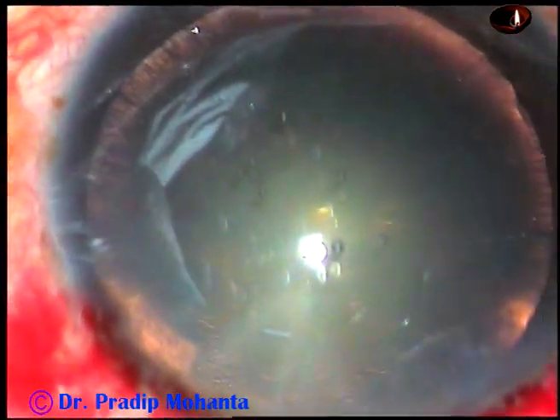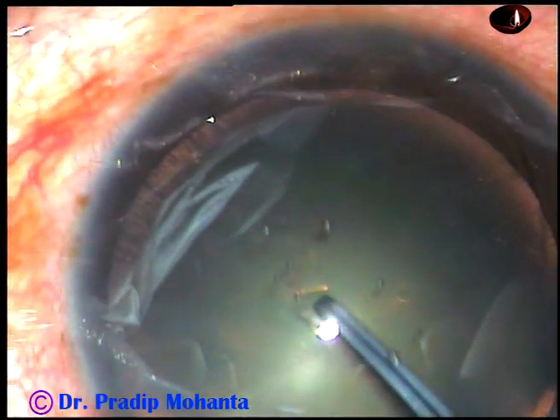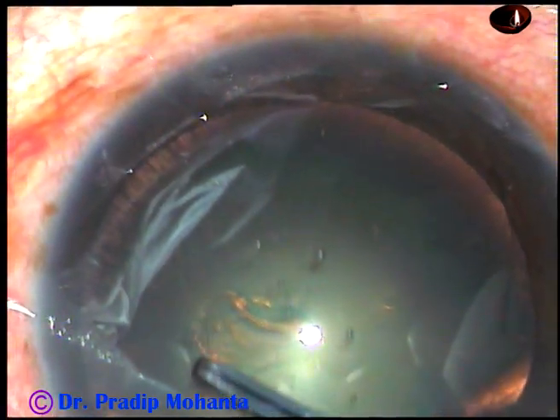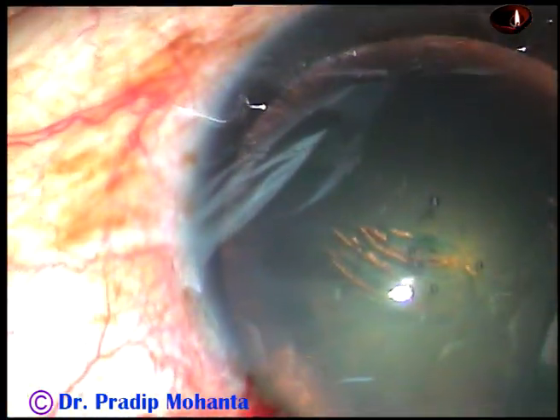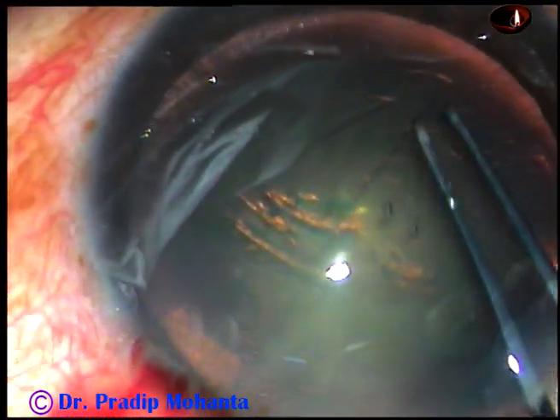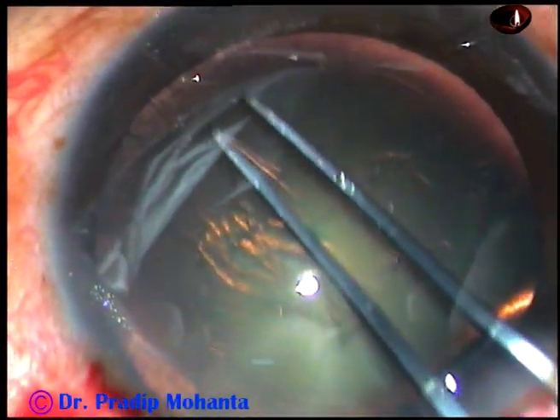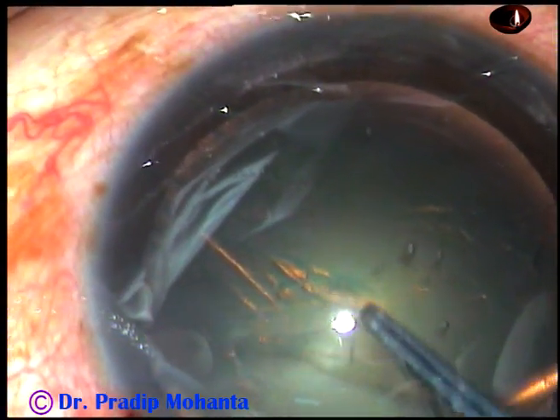Now capsulorhexis. I am going to use a utrata forceps for doing the capsulorhexis. The anterior capsule is torn. A capsular tag is raised. This capsular tag is held with the utrata. It is guided in such a way that we get an adequate sized rhexis of 5.5 mm or even 5.75 mm.